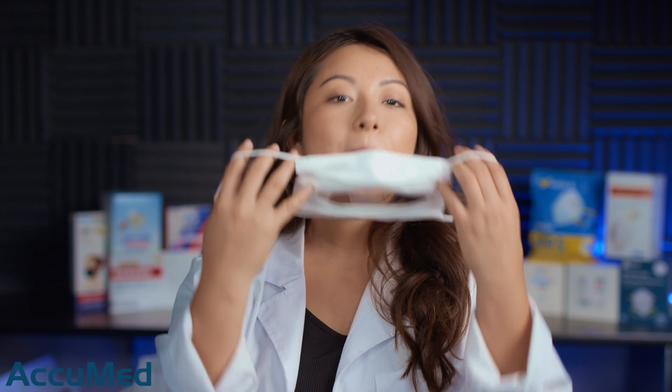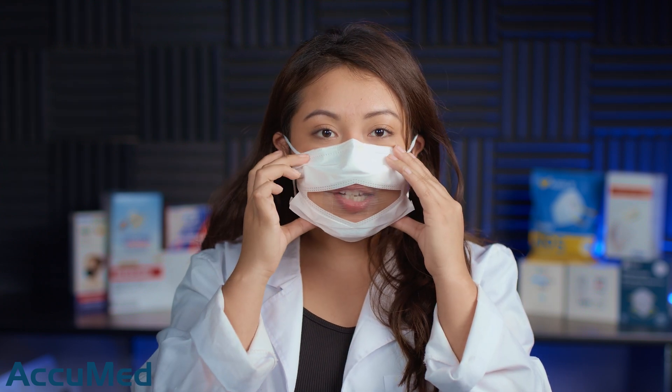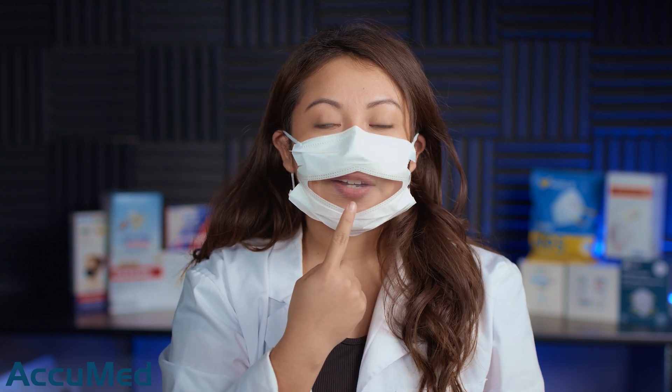I'm going to put these on really quick before we run them through our TSI machine. They do actually come with a nose wire. I'm going to play around with the nose wire — it's so weird that you can actually see my mouth. One thing I am going to point out is that it does build up a lot of condensation. I feel like I am getting a lot of moisture and you can tell it's getting foggy, and also my lips are touching the mask as I am talking.